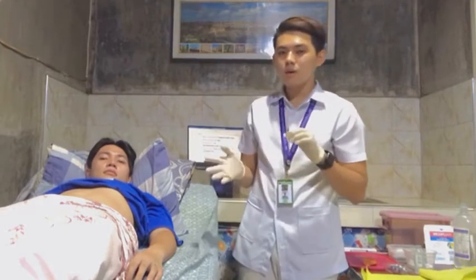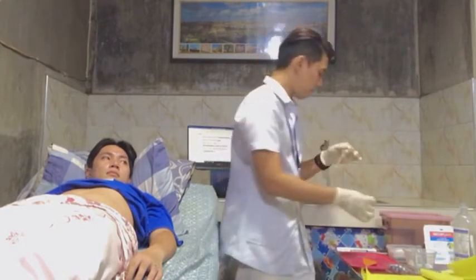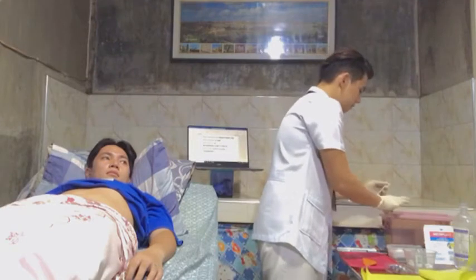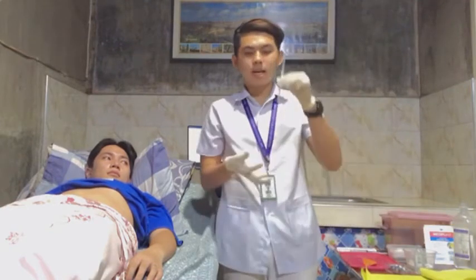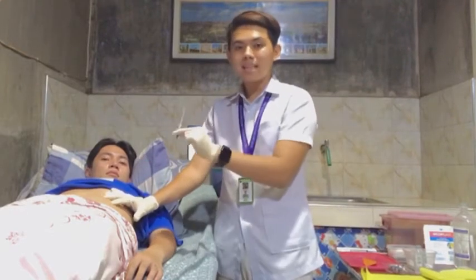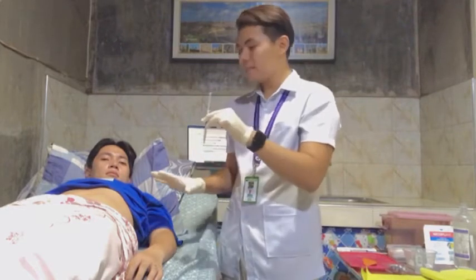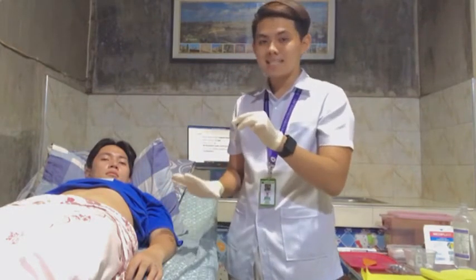So of course, remove the needle cap by pulling it straight off and hold the syringe between the thumb and the forefinger of your dominant hand. It's like you are holding a dart. So first we must remove this one, then hold it like a dart. And of course, we need to insert the needle quickly and firmly at a 45 or 90-degree angle, and pain is minimized by inserting the needle without hesitation.